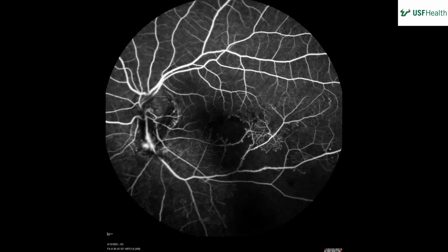So it's a fluorescein, so you're not really seeing the choroid because the RPE blocks it. You said there was hypoperfusion, but which vascular bed would that be? Of the, I guess just blood vessel loss. So it's just that dark. So you see hypofluorescence. Yeah, there's a dark hypofluorescence there. So it's either got to be blocking or non-perfusion. So that looks like a pretty wide area of non-perfusion.